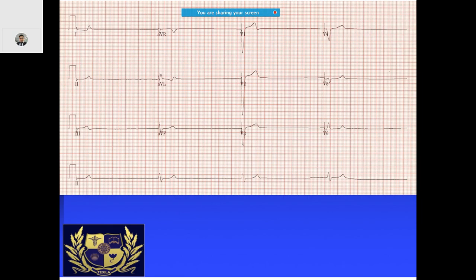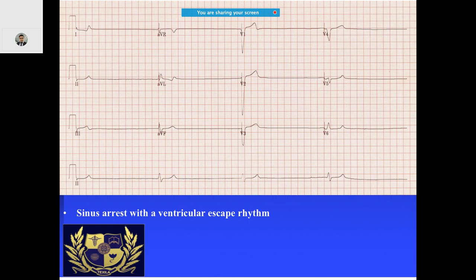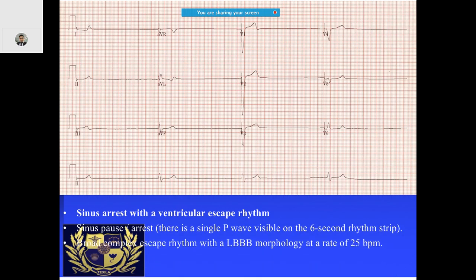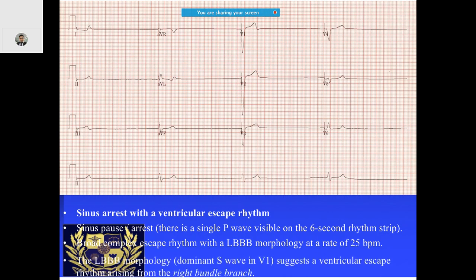In this ECG, this is a patient who had already undergone thrombolysis. After thrombolysis was done, this ECG was seen — it is characteristic of ventricular escape rhythm. This is not ventricular tachycardia. You also notice what is called a sinus pause arrest, because there is a single P wave visible only on the 6-second rhythm strip.